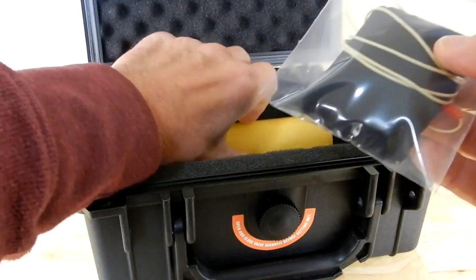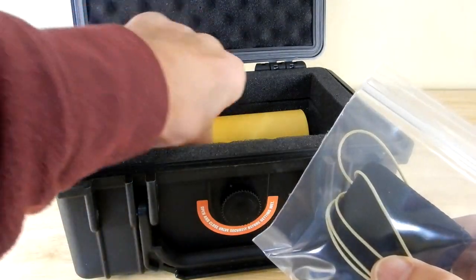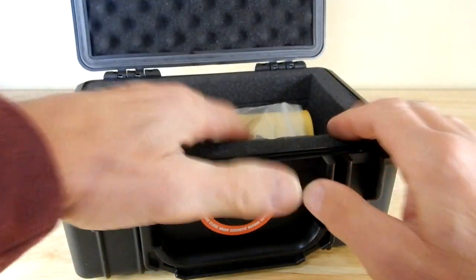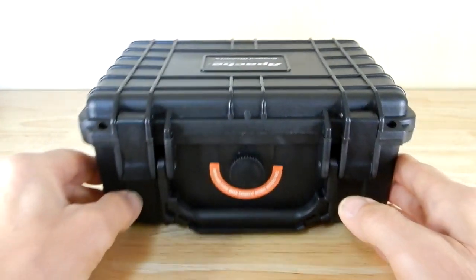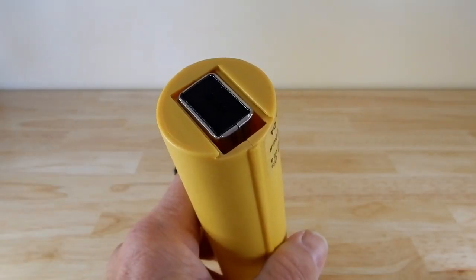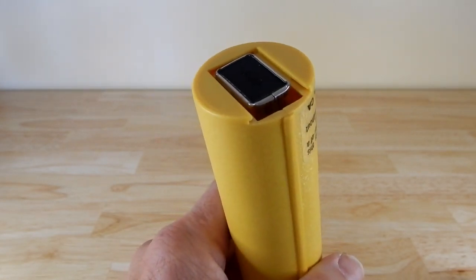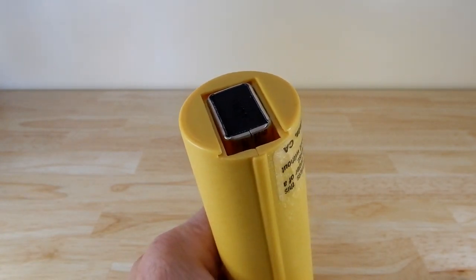Before you put this away — whether in a case or anywhere — make sure that not only the tip of the unit but also the pad, which you have to soak, is totally dry before storage. When I store this, I make sure the battery is not in it, because you never know if it might start to leak. I take the battery out and put it in a plastic bag inside the box.